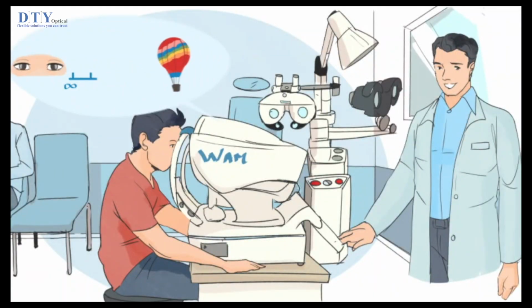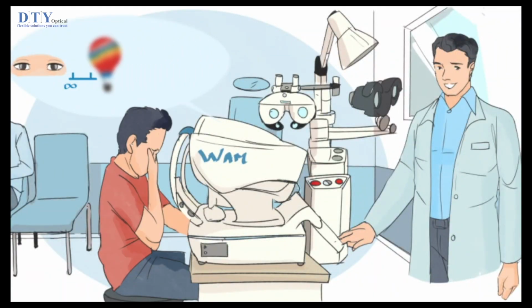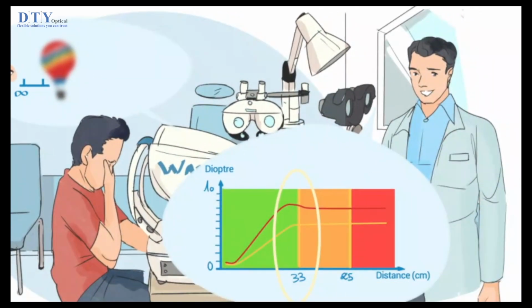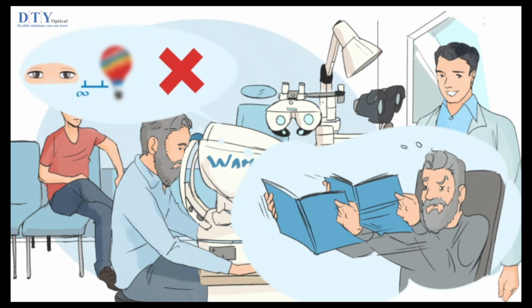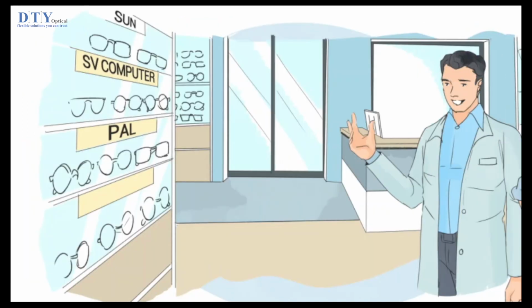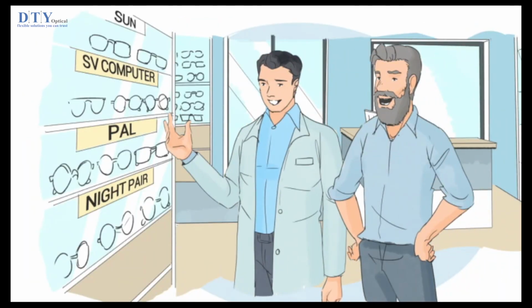This eye strain feature is a tool for education purposes only in order to raise patients' awareness. This indication is aiming to help the eye care professional build his lens pitch and address the most appropriate category of lenses.